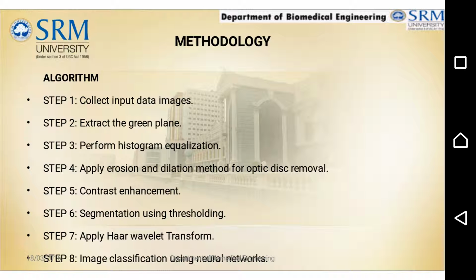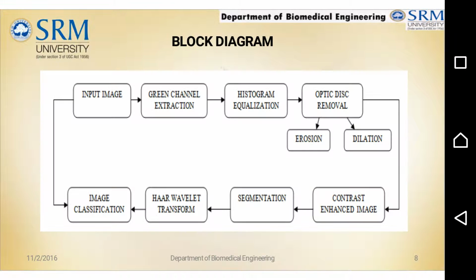Collect input data images, that is the fundus images, extract the green plane, perform histogram equalization, apply erosion and dilation method for optic disc removal, contrast enhancement, segmentation using thresholding, apply Haar wavelet transform, image classification using neural networks. These steps are clearly explained in series in the block diagram.